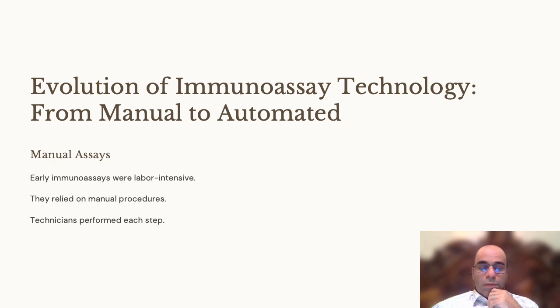Therefore, technicians performed each step of the process from sample addition to incubation timing, washing, and result documentation.